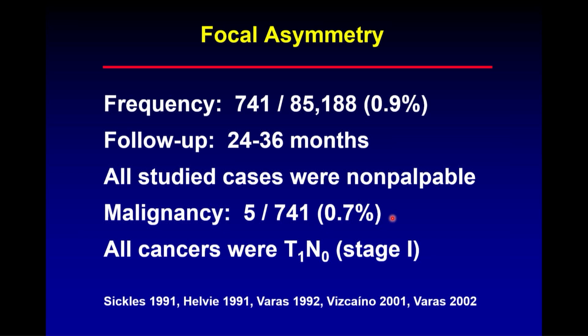However, in the modern era, as we practice now, 90% of your patients have priors. Only in our practice, only about 10% of the patients have no priors. So this doesn't pertain, because we use the priors to help us decide what to do about focal asymmetry. And that's going to be a bulk of what we're discussing today, is how to use those priors.